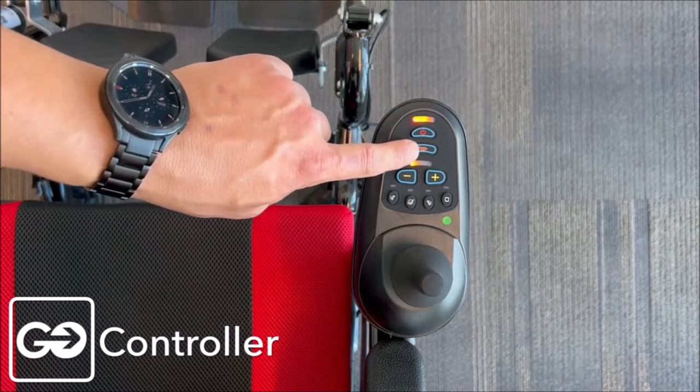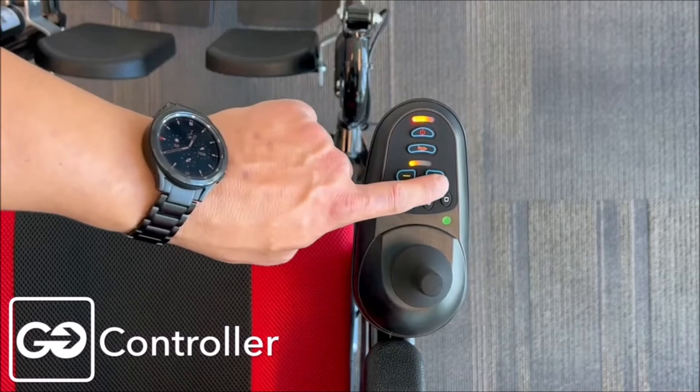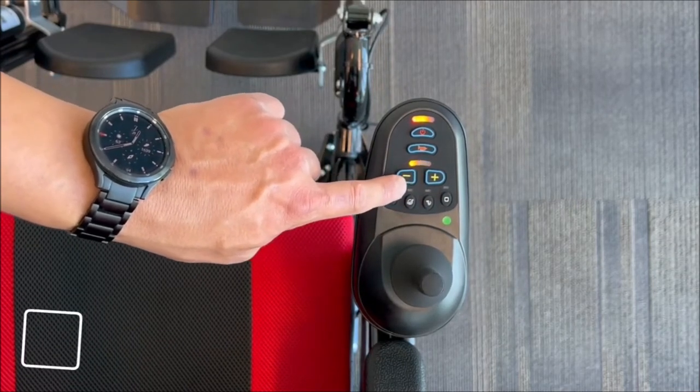A full battery would show in the green, but we're showing orange right now. We have other buttons here — the horn, and the speed buttons, plus or minus. We can increase the speed by pressing up and decrease the speed by pressing down.